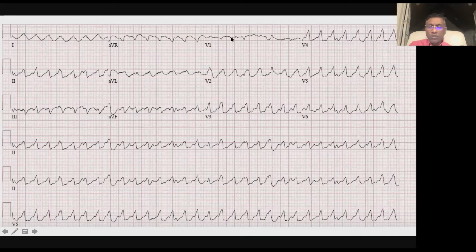So when it's atypical, it's VT. There's one more clue over here someplace. So let's look down at this lead in V5. Any clues you see in V5? Look at this part of the tracing. See if you can make anything odd, which I will grant you is not 100%, but it's kind of suggestive. It's a possible. I didn't really talk much about any V5 criteria. I'm thinking more of the rhythm.